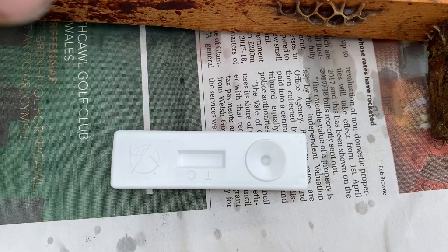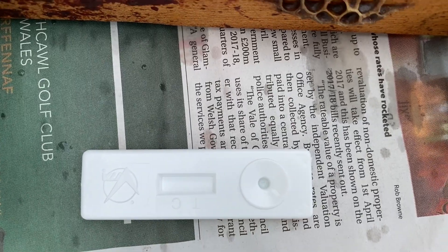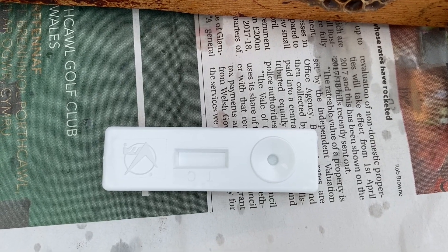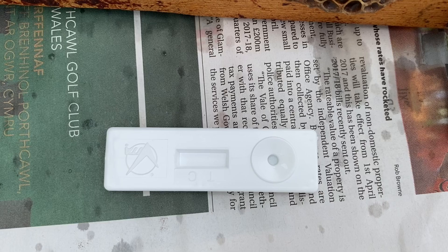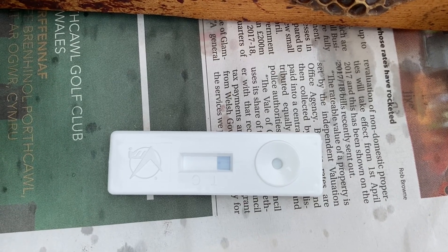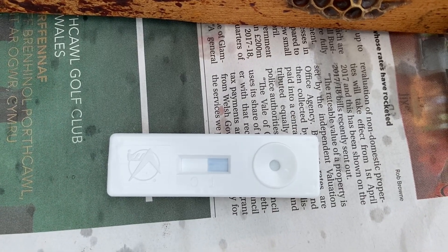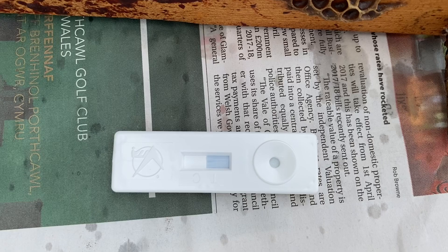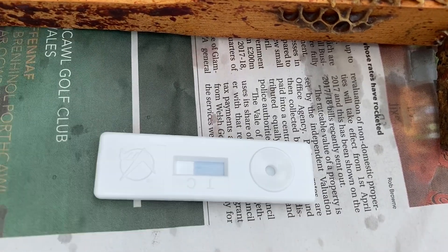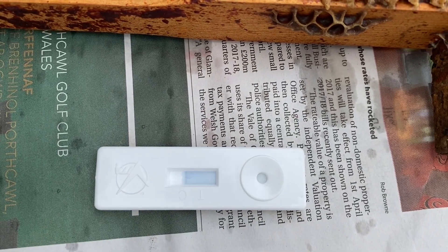If there's two lines then that's a positive, but if there's only a line on the C that's a negative, and that's what we're hoping for — just to get the one line on the C. The solution is coming down now. No line on the T — there's the control line.